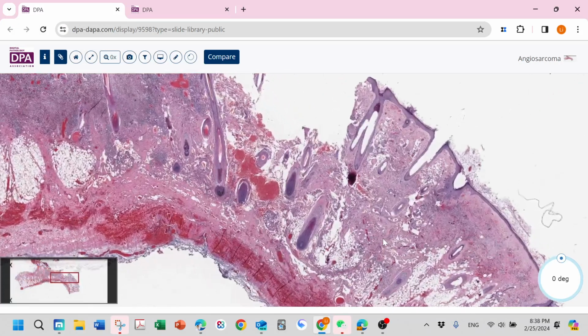And you also need to be really cautious if you have a vascular-looking lesion that is not really classic for angiosarcoma, and when you do the immunostaining, CD31 negative, ERG positive, and you would like to call this angiosarcoma, you need to be really cautious, because I happened to have a case that is myeloid sarcoma. For this myeloid neoplasm, they may have ERG positive. So do not rely on one marker to make your diagnosis.